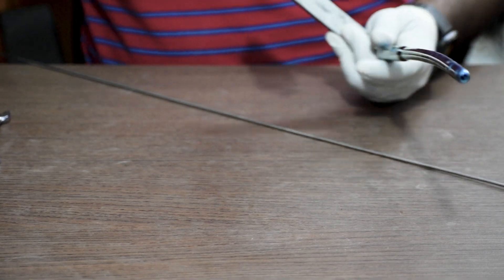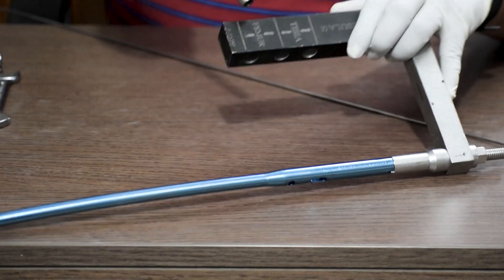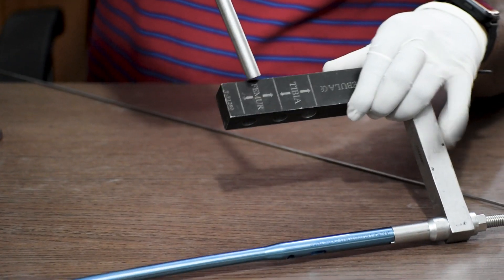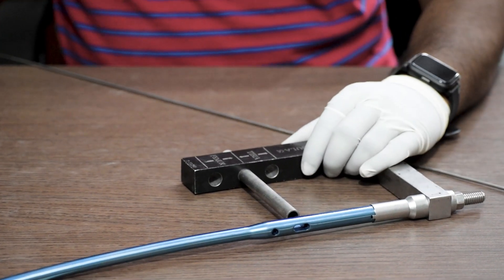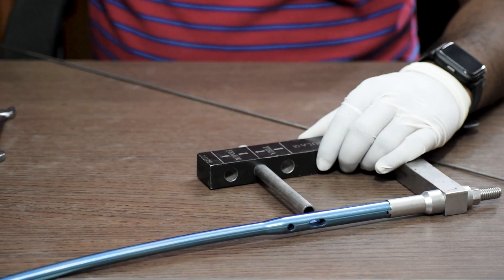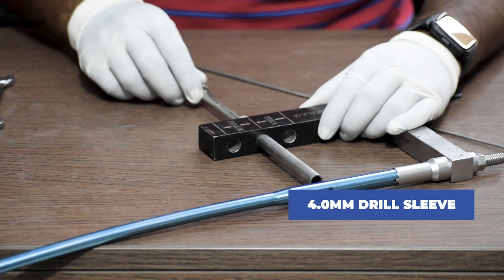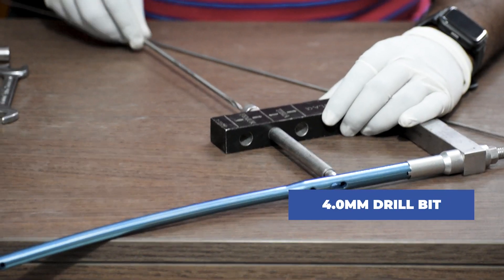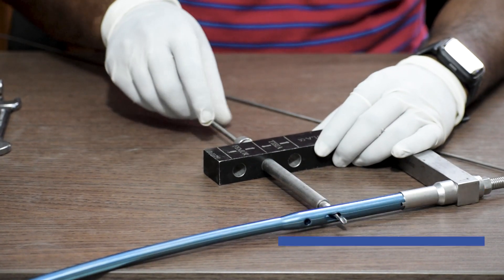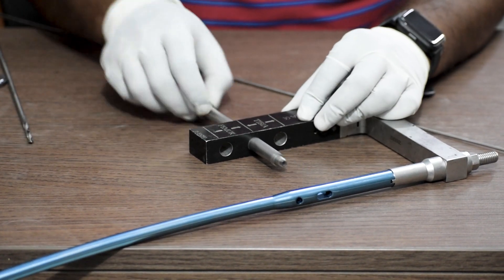After this, we will first check the alignment of the nail before inserting it, so that no complications arise. To do that, we will insert a protection sleeve in the marked femur region in these two holes. After the protection sleeve, we insert the 4 mm drill sleeve and check with the 4 mm drill bit that it is properly going through with no obstructions. We repeat the same process for the other hole as well.